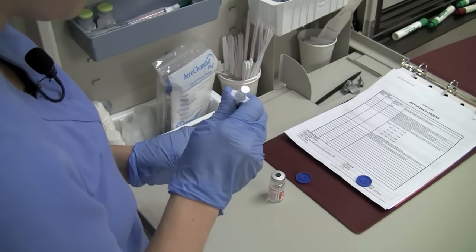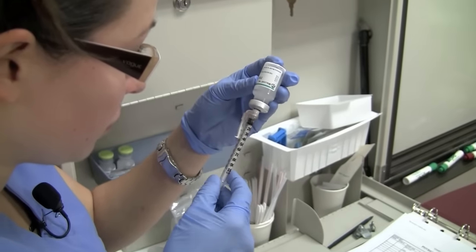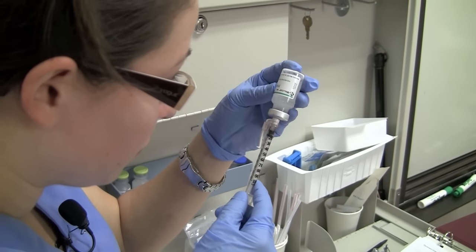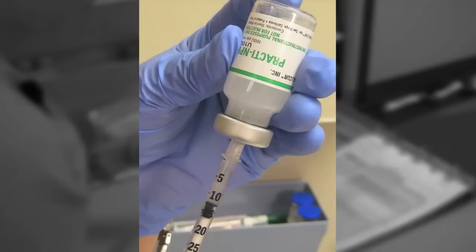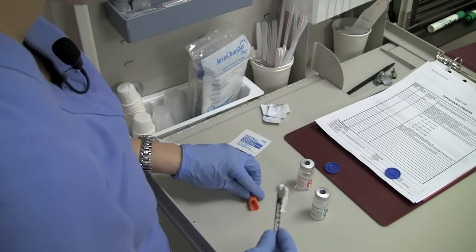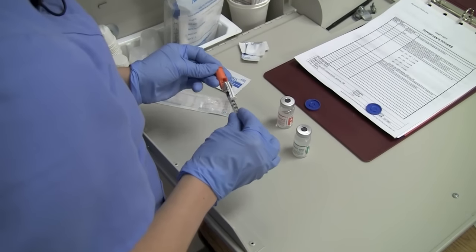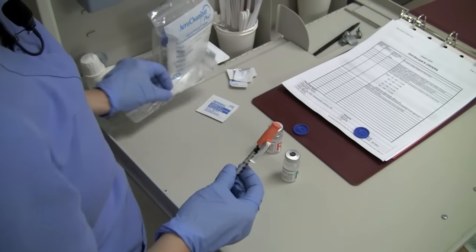Reinsert the needle into the NPH vial and withdraw 30 units of NPH. Withdraw the needle and replace the cap over the needle using the scoop method to maintain sterility.